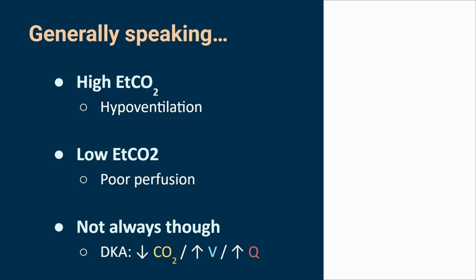They're perfusing just fine, yet all the same, their CO2 might be low. Kind of in the inverse, right? In a certain sense, we don't want to look at a guy in DKA and see his end tidal at 32 and be like, oh, snap, he's not perfusing. Like, no, he's just acidic and he's breathing off too much CO2. That's why.